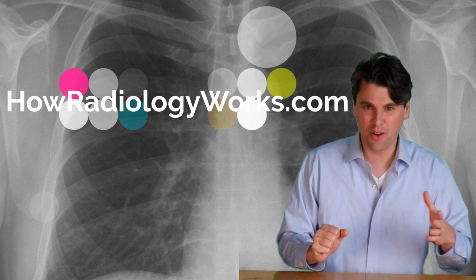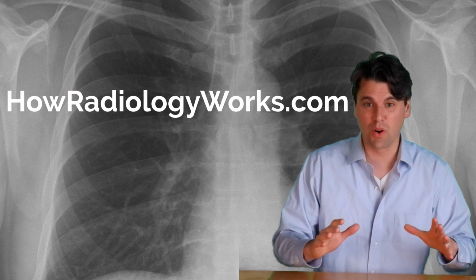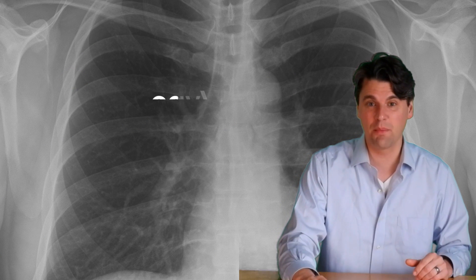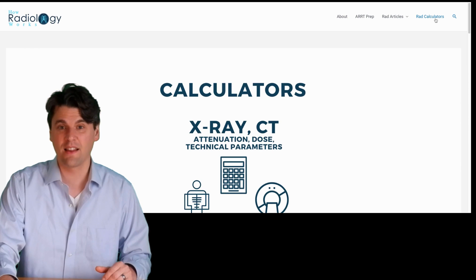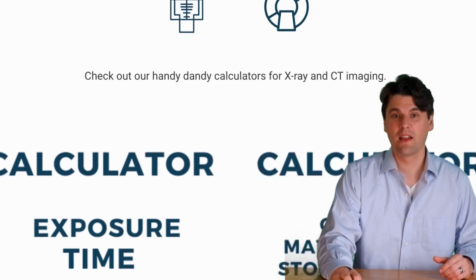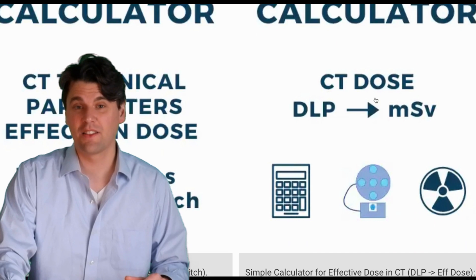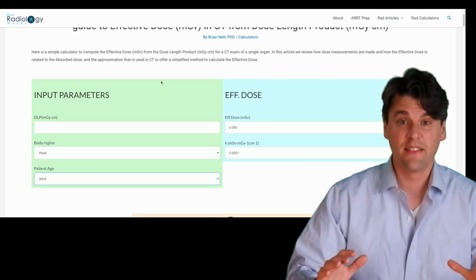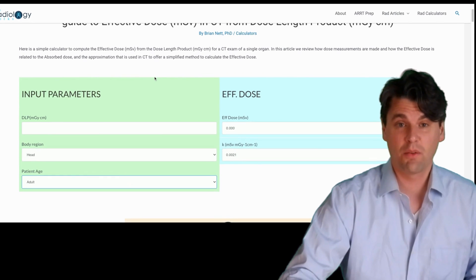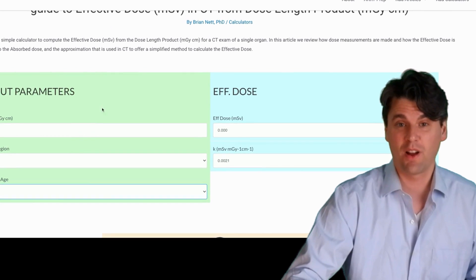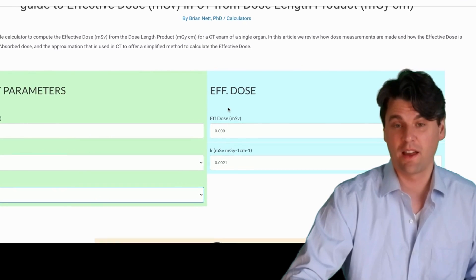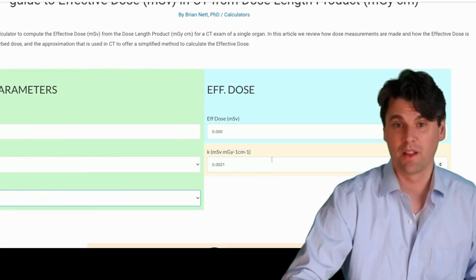To the calculator — go to howradiologyworks.com, click on the calculators in the upper right hand side, go on down just a little bit, click on the calculator that's DLP to millisieverts. And this is our calculator, where on the left hand side you have your input parameters, and on the right hand side you have your output.